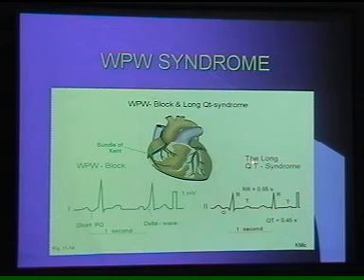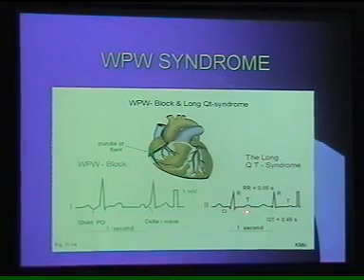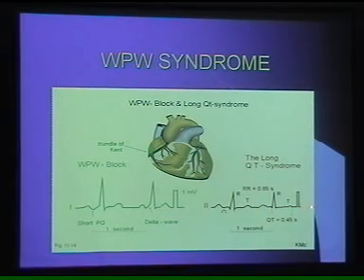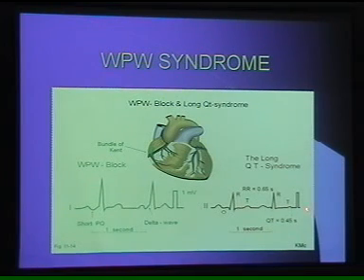That incidentally is just the presentation of long QT interval, which we already discussed. Here again you can see that the QT interval is prolonged, and here it is progressively prolonged under the influence of the drugs.